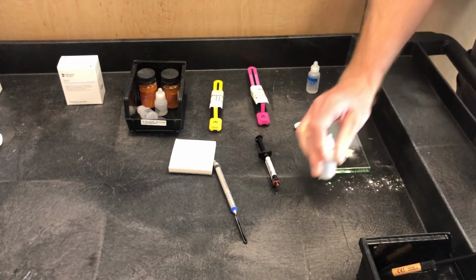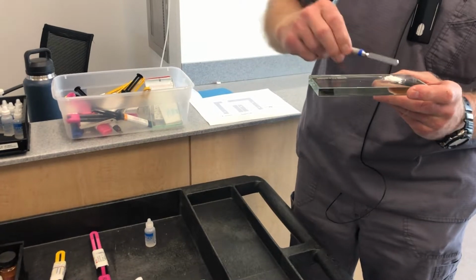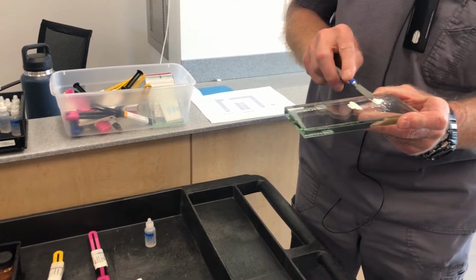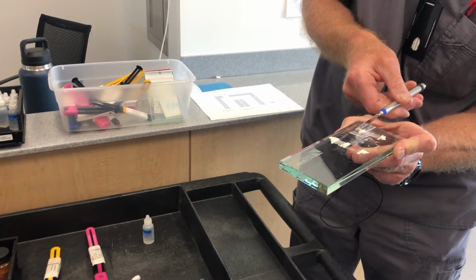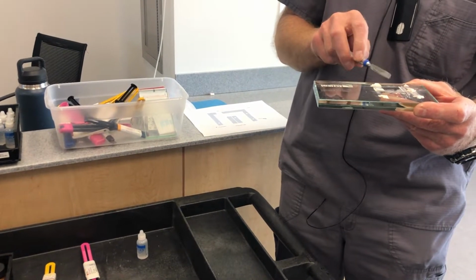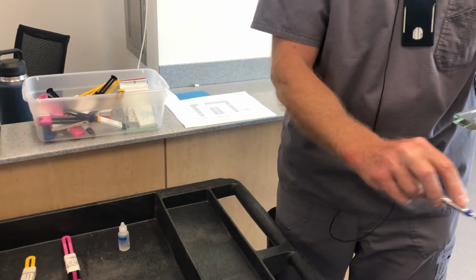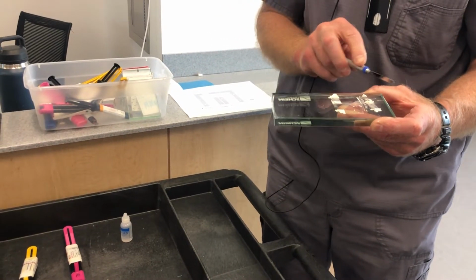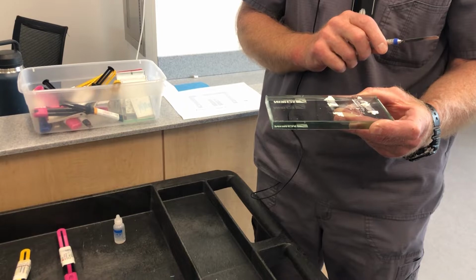And then you'd measure out your liquid, and you would take your powder and divide it into at least 6 equal parts. So you take it and you do that, and then that, and that, and then you dispense your liquid next to it, and then you would start mixing over the course of 2 to 3 minutes. You put the powder in, spreading it out across the glass slab to keep it cool, but do it incrementally. If you add all the powder in at once, it'll set almost like that. It slows the set down if you mix the zinc phosphate incrementally.